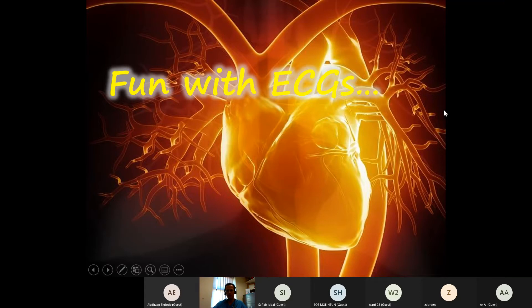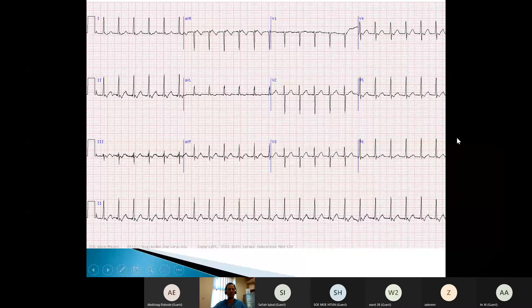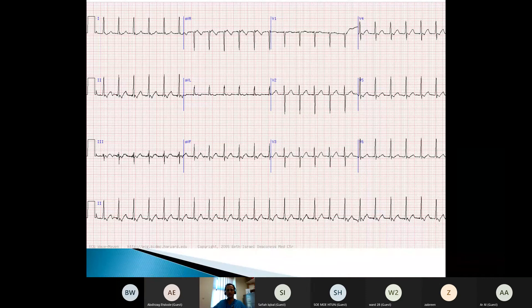So the ECG for today is this one. Does anybody want to have a look at this ECG and tell me what they make of it? So what do you think of this ECG?